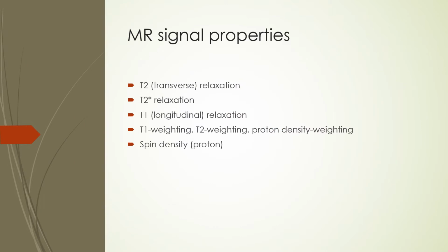So far, we have learned about the rotation of an object in a magnetic field. We used the model of a hydrogen atom or proton with spin and placed it in a magnetic field. We saw that when the proton is in a static magnetic field, it will have a bulk magnetization that is in equilibrium with the field. The bulk magnetization precesses due to the presence of spin and the magnetic force due to the static B0 field.